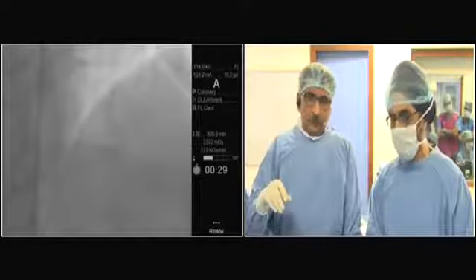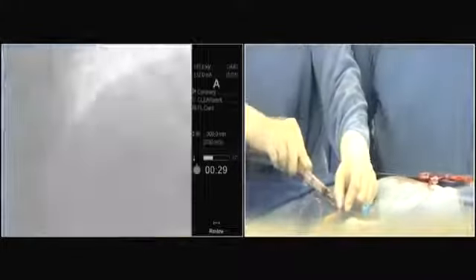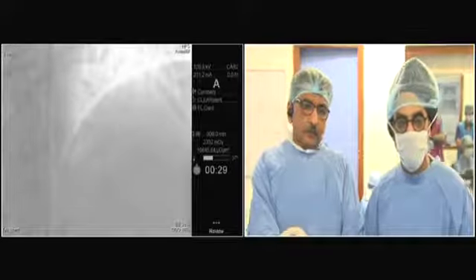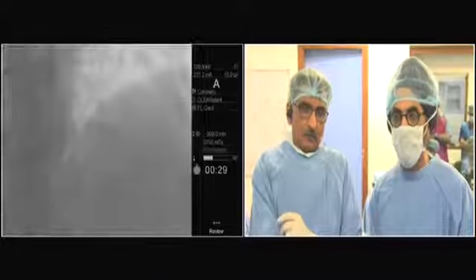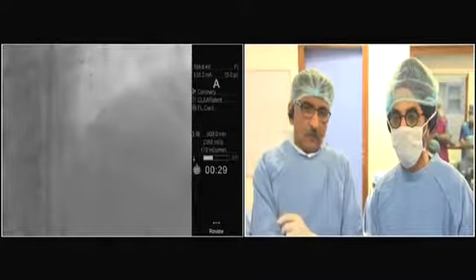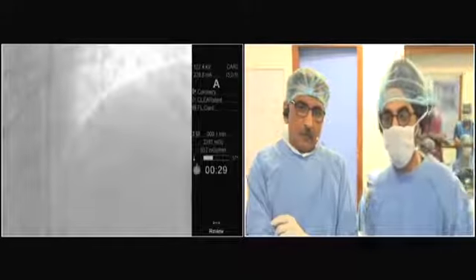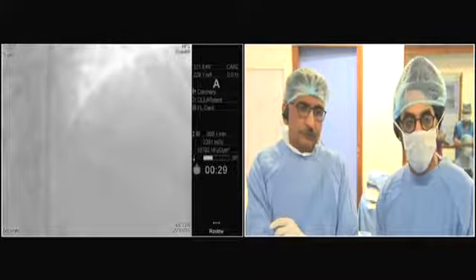And if you use the crush technique quite often, do you sometimes use the DK crush to help facilitate crossing again? Or do you usually do the single step crush? No, I elected to use a single stent crush in this patient looking at the calcium, that it might impede me getting another stent or getting the balloons or doing the kissing too repeatedly. That's why I saw that calcium on IVUS, and actually I was prepared for a rota also, but my reason to use a single crush was to avoid difficulties in pushing stents later on.